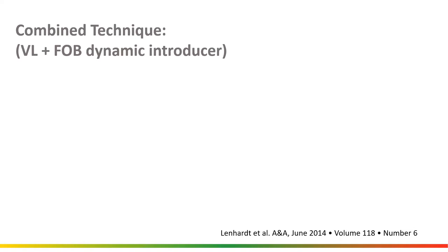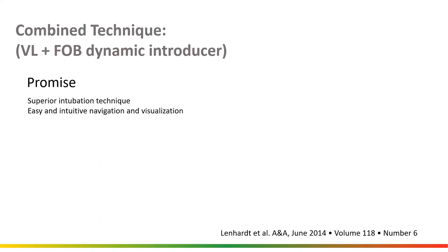Combined technique, VL plus fiber optic. The promise is that it's a superior intubation technique, and this is what the literature and all the studies show. It's easy and intuitive for navigation and visualization. Both the visualization component is now easier with the video laryngoscope, and the tracheal access component becomes easy with a dynamic introducer.